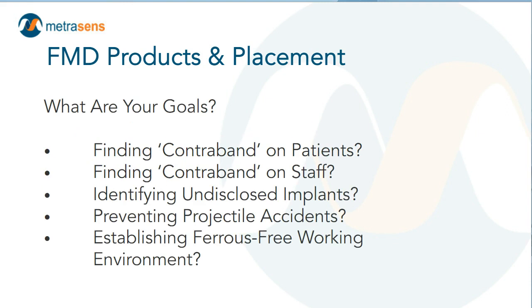Ultimately, your choice of ferromagnetic detection products and where you place them should be driven by your goals. Are you interested in finding the stuff that patients may be wearing or carrying on them that they didn't take off if you have them change, or you scan them in street clothes and you just want to make sure that they're not bringing their rodeo belt buckle into the room? Are you interested in the same question, but instead of patients, we're asking it about staff, maybe transport, maybe anesthesia, maybe somebody else who's accompanying a patient to MRI?